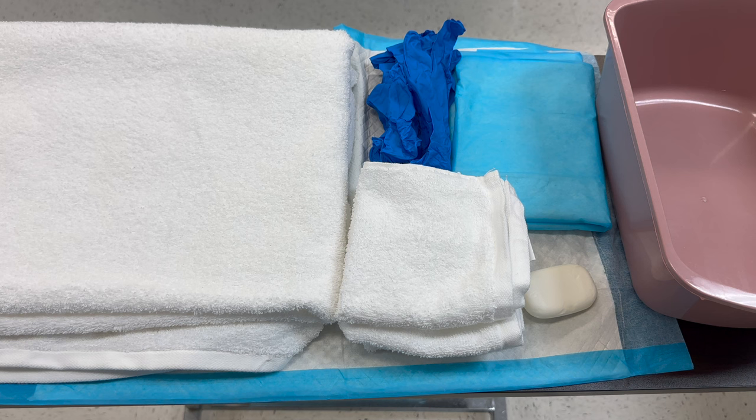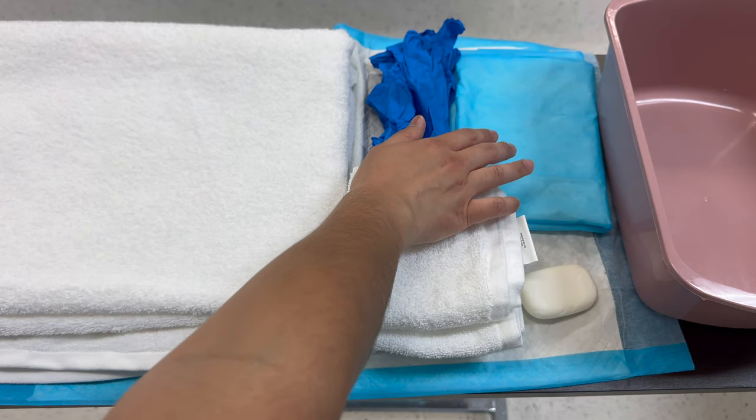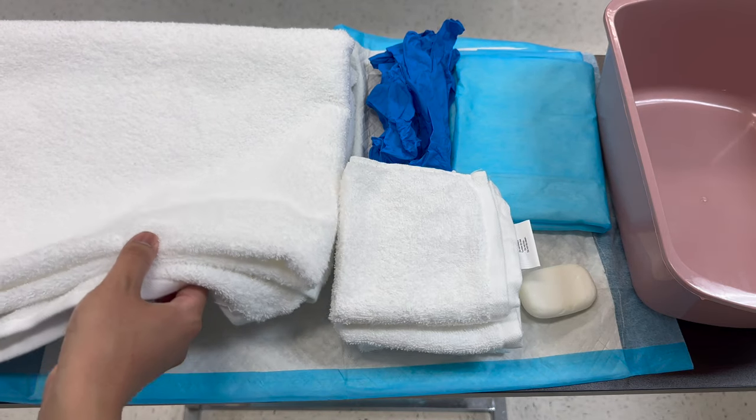Skill 18 provides catheter care for female. The supplies you're going to use are two sets of gloves, two chucks — one for the table and one for the patient — soap, a basin, three washcloths, and one large towel.